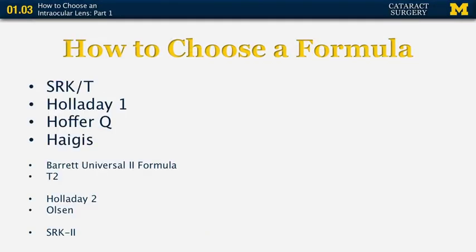There are several formulas available, and the 4 that are on most machines are listed here. There are 2 other formulas that are available for free. They're on the web. We'll talk about those in a minute. And then there are these 2 formulas that are available for purchase.